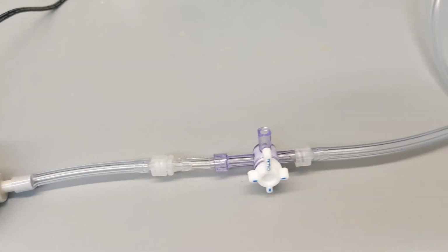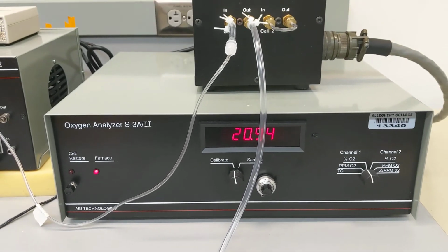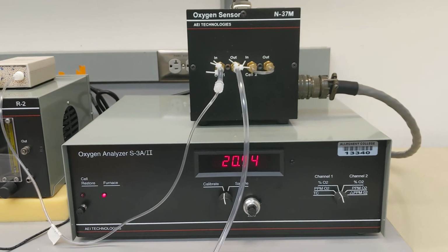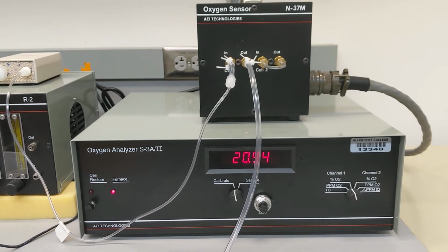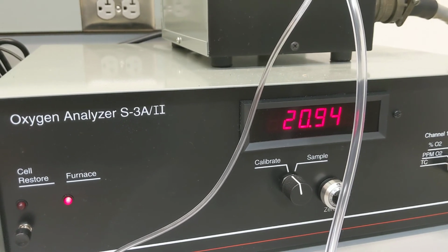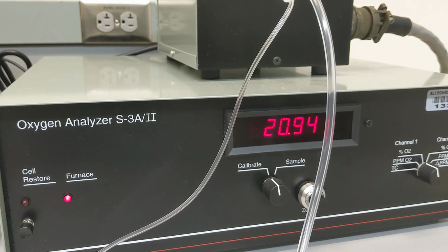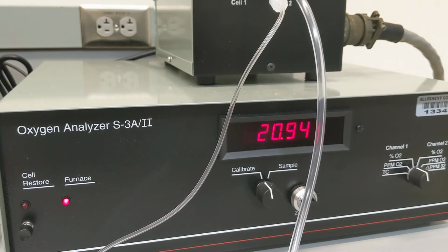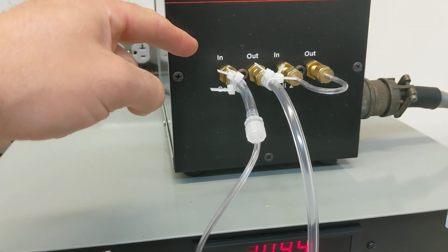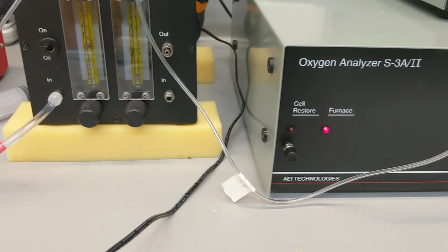So let's follow it back. Here's where the air is going to be pulled from. Follow this tubing, and we're going to see that it's coming in through this chamber right here, and this is actually the oxygen sensor and oxygen analyzer. So we can see right now it's measuring 20.94% oxygen concentration, which is the percentage of oxygen in atmospheric air. Right? So it's being pulled in this direction, right? We'll follow this back. Where is it coming from?